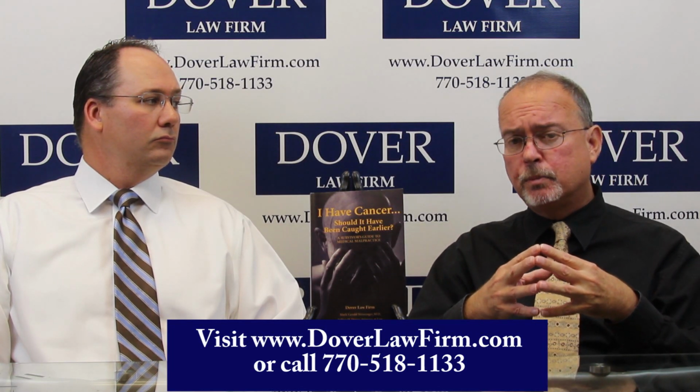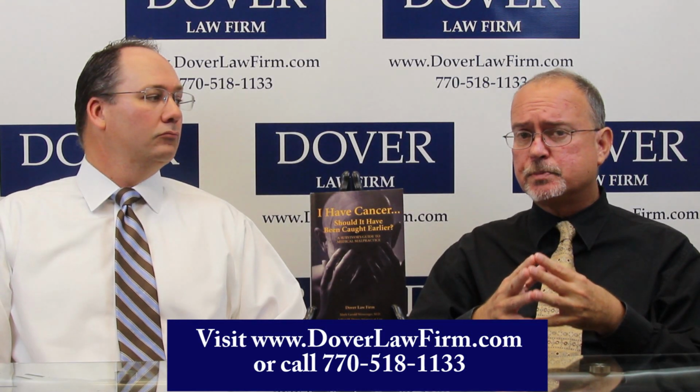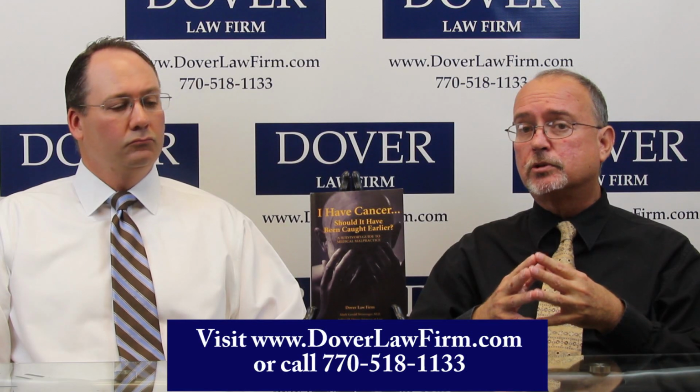Now, barium enemas are still an appropriate diagnostic technique, and typically they're available in areas sometimes where colonoscopy is not. So it's an appropriate way to do screening. Although it can be uncomfortable, it still has its place in medical diagnostics for colorectal cancer.